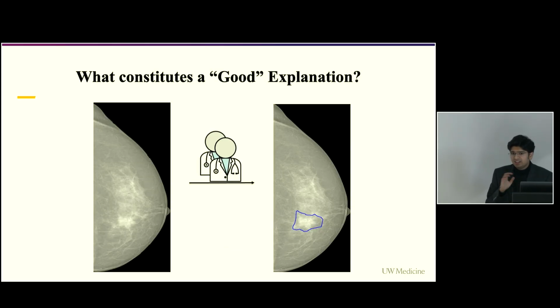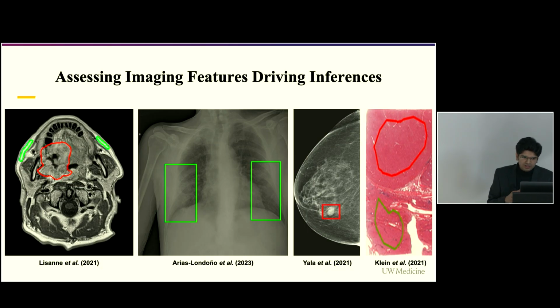For example, a clinician may go about reading the entire mammogram and potentially delineating where the tumor is present. Essentially, their qualitative interpretation will be more meaningful when they are able to locate the exact position of the tumor and say that cancer is present on this mammogram. So, do we feel that such bounding boxes, such segmentations could be really helpful? Let us say we have a deep learning model, or an explainability technique wrapped on top of it, that essentially helps us understand where exactly the model was looking while making these predictions.